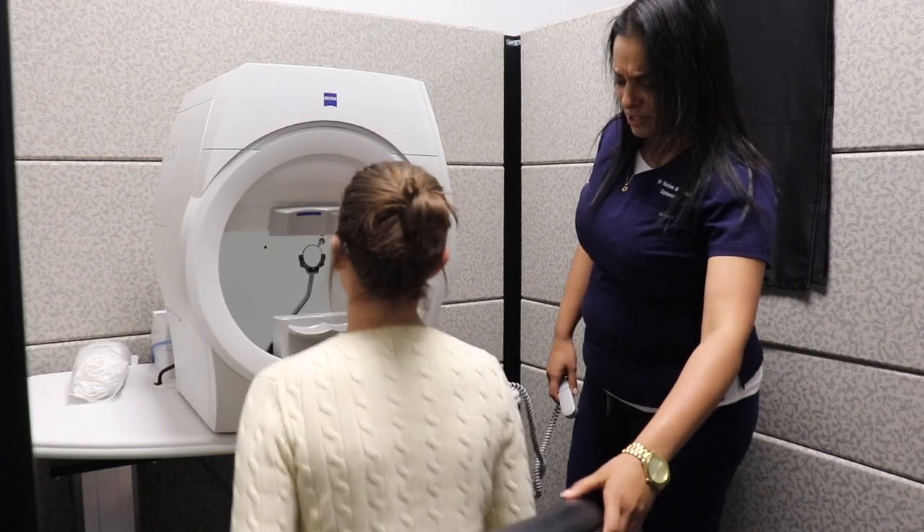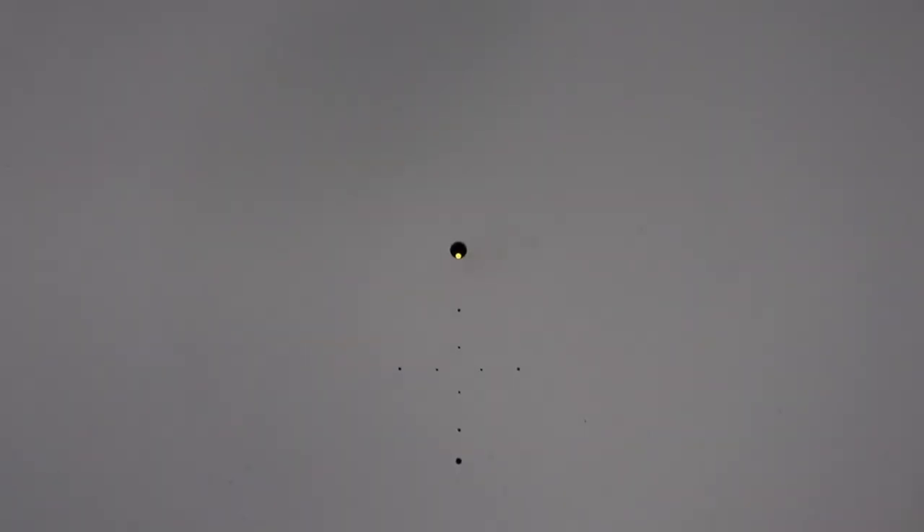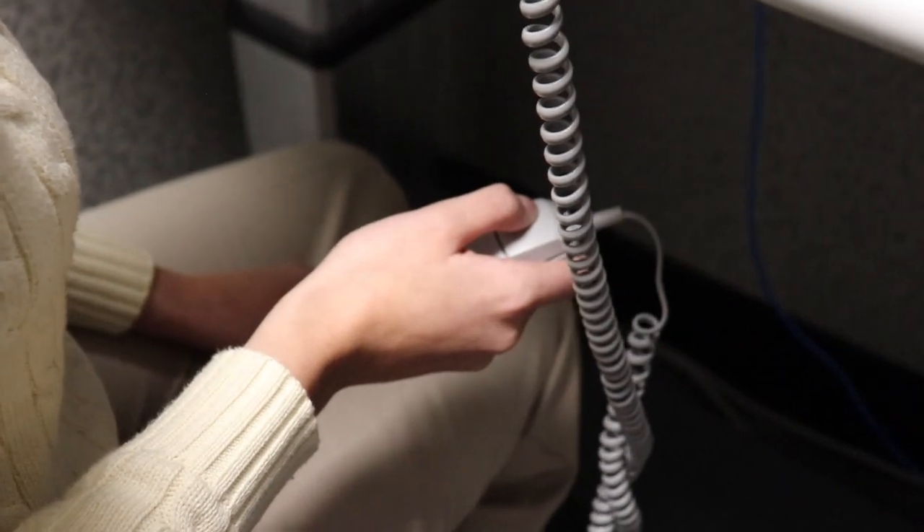For most instruments, what that's going to involve is the patient sitting at the instrument and looking at a screen. There's going to be a central dot or fixation point that the patient is going to look at, and as they're focusing on that dot, there are going to be lights presented in their peripheral vision. They're going to have a button that they click every time they see one of those peripheral lights. These lights can either be static or kinetic depending on the needs of the patient and what exactly needs to be tested.